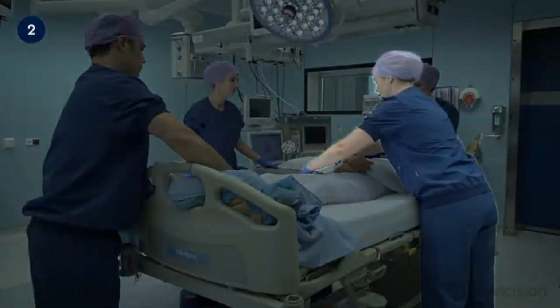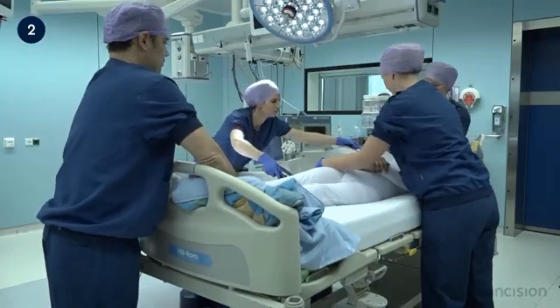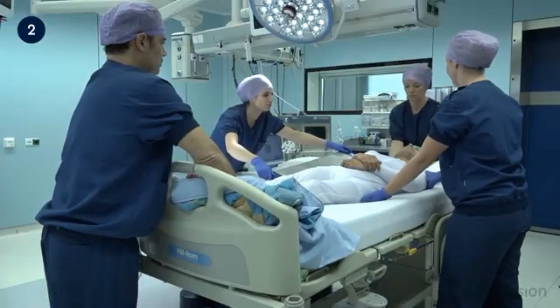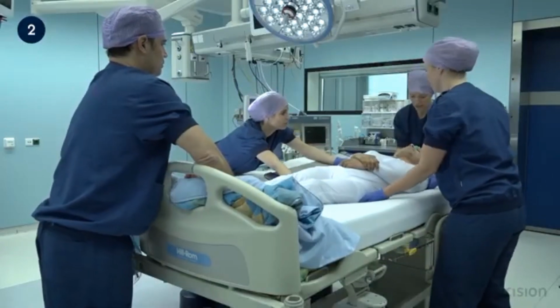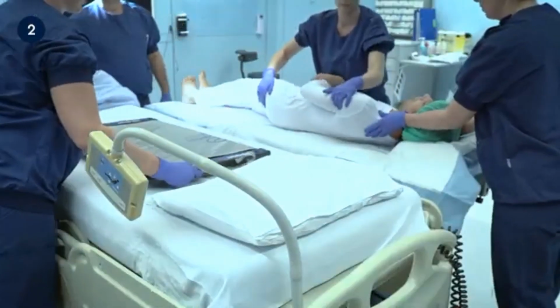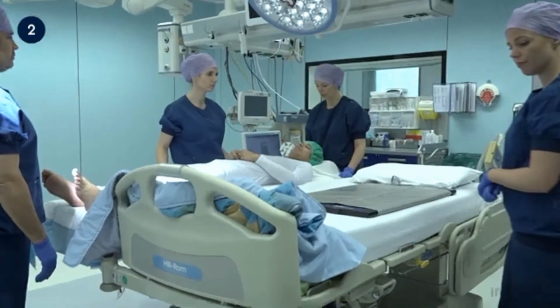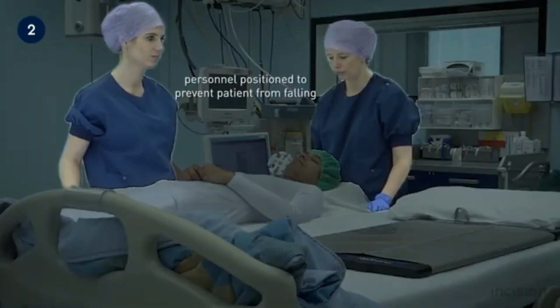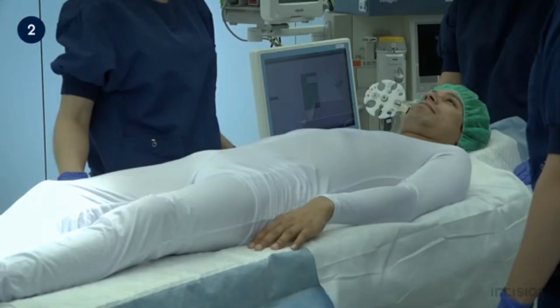With 3 team members turning, the 4th team member positions the rollerboard underneath the patient, as now shown. With the transfer leader giving direction, usually by way of counting, the patient is transferred onto the surgical table. Once on the table, the patient is once again rolled onto their side and the rollerboard is removed. Take note of how the team members positioned next to the surgical table maintain their position close to the table, preventing a potential fall. The other operating room staff move the bed.